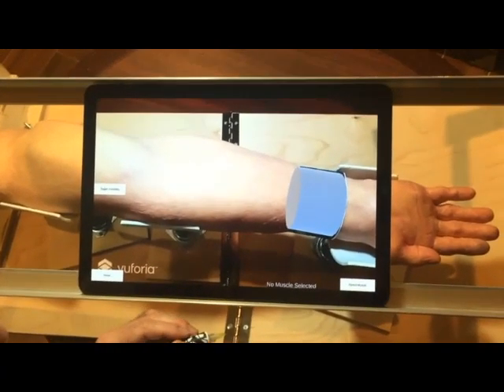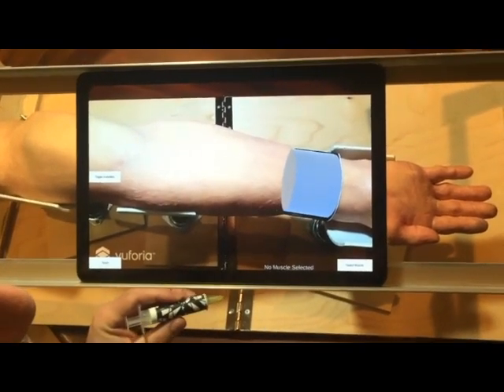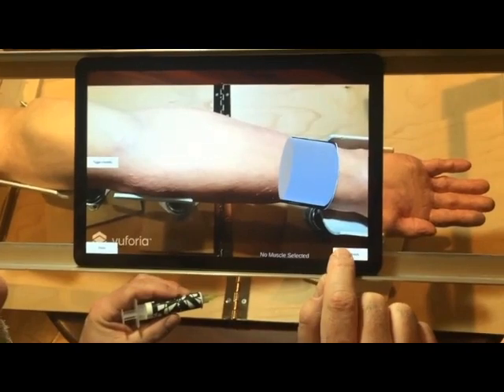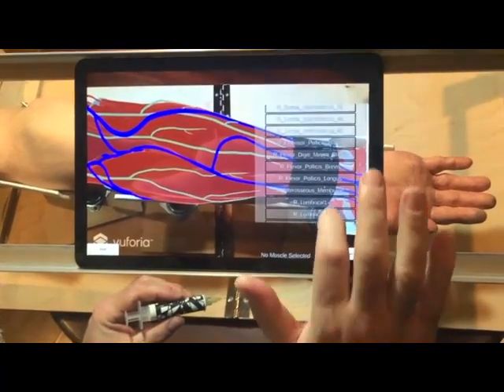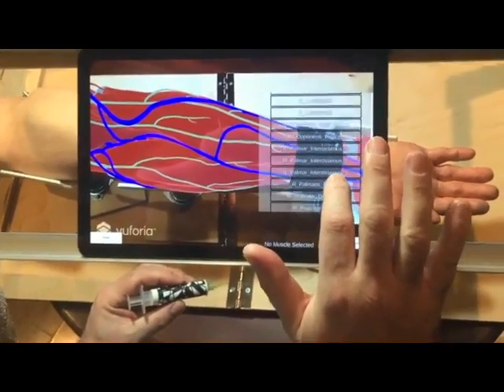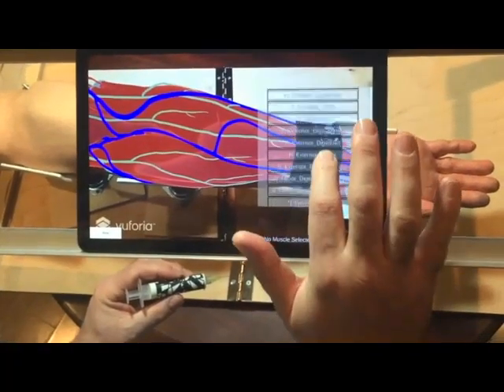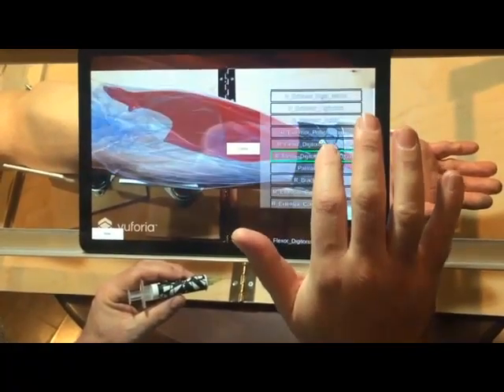Simply select the muscle from the drop-down menu, which is verified by a glimpse of the muscle on the anatomical view of the arm. Once you agree this is what you want, press the on-screen confirm button and the selected muscle label will be displayed in the lower right corner.